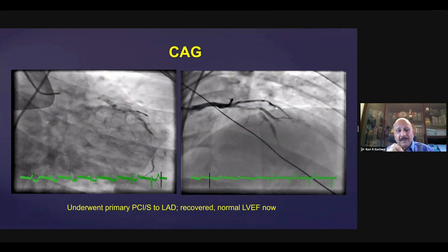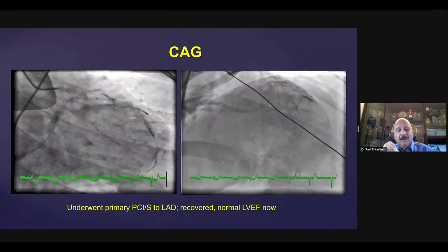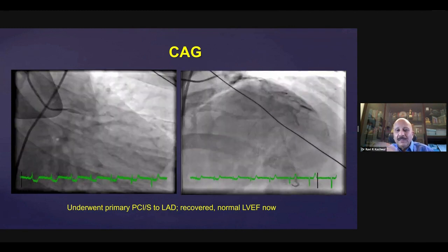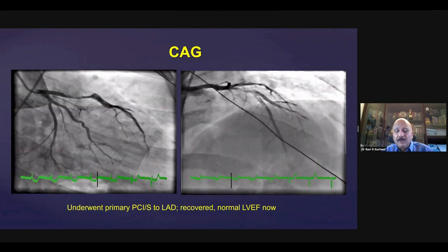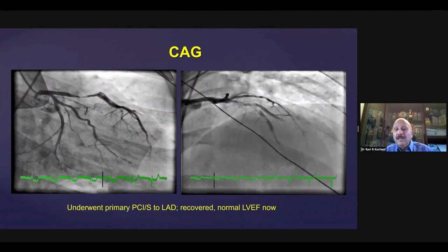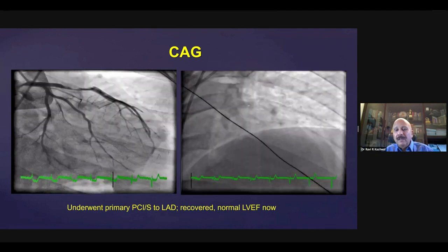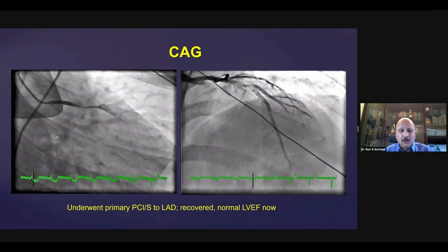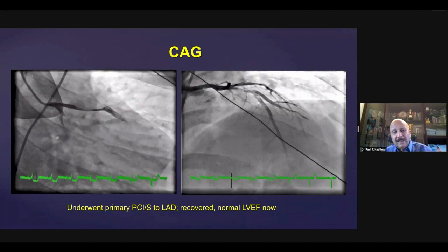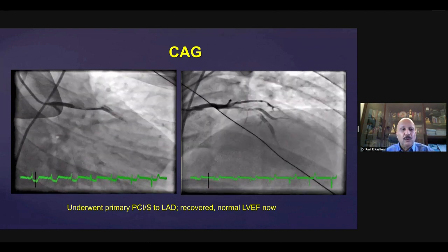And here I may just take 30 seconds off and say it's not about just picking up coronary artery disease in the ER, but it's also saving us from a disaster like thrombolysing a dissection of aorta, or giving aspirin to a dissection of aorta, or you may find hypertrophic cardiomyopathy, or you may disclose constrictive pericarditis. All these things can be diagnosed with an echo done in the emergency room. So that's where the value of echocardiography comes from. Emergency room to your ICU, to the cath lab, to the OR, to the outpatients, for CAD, it is echocardiography all the way.